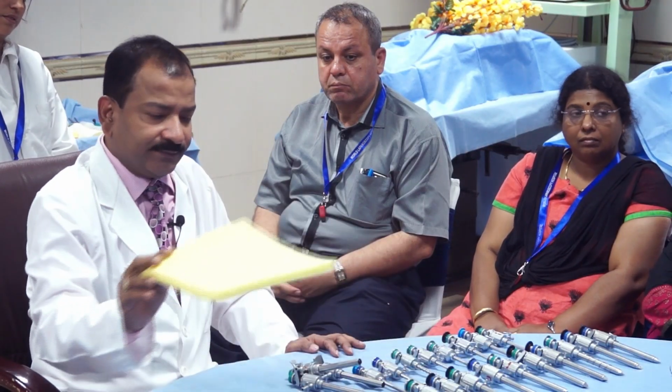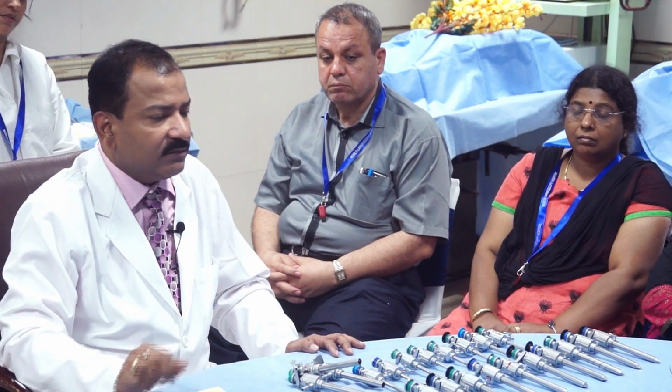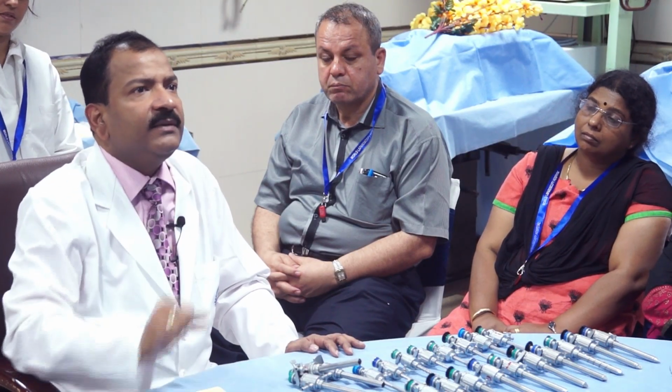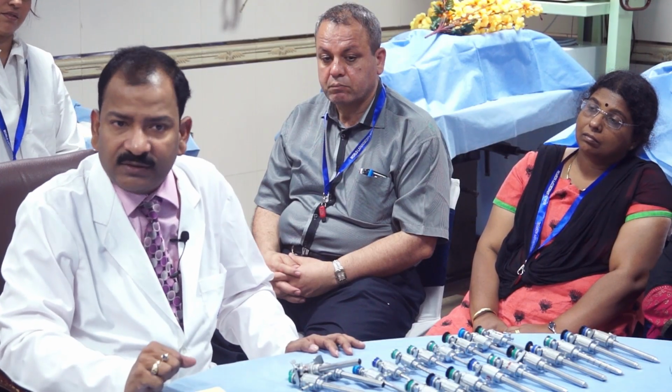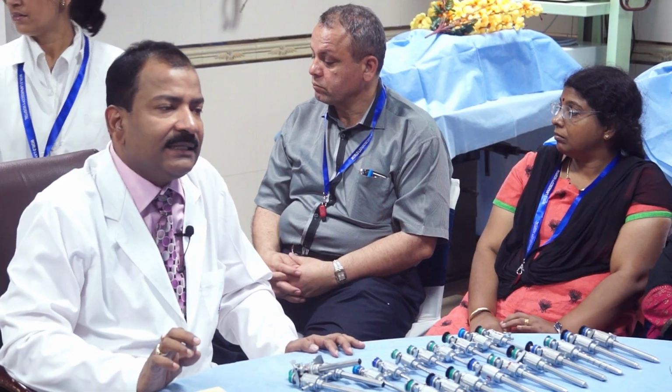Exactly the same way, once the uterine artery starts bleeding when you do surgery, then we think, oh, the uterine artery is bleeding, this is very bad, so surgery is not good. But we should not see it this way. We should try to find out the ergonomics. Where was the problem?